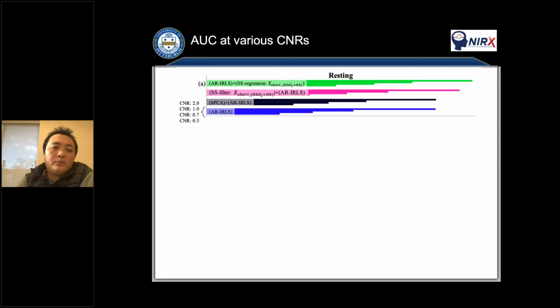So what happened when, because in the ROC we can set the contrast to noise ratio. For the previous slides, every slide, we use 0.7, because in our experience in other data sets, 0.7 is the contrast to noise ratio in our typical study. The contrast to noise ratio is defined as the peak magnitude of the evoked response to the standard deviation of the oxy and deoxyhemoglobin.